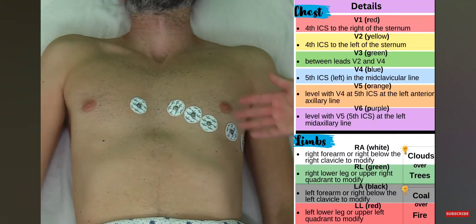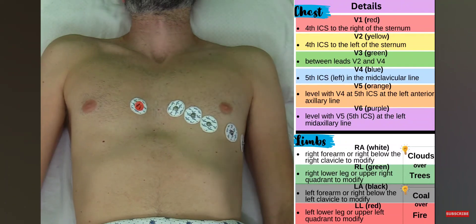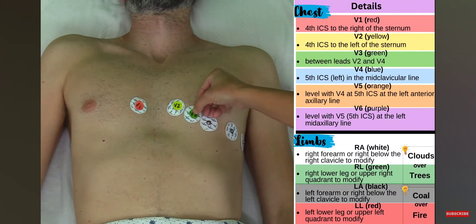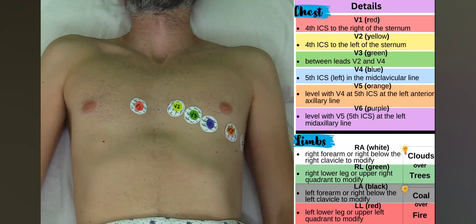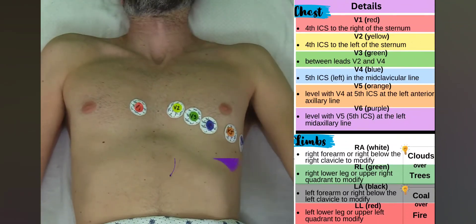Now let's go over the colors of the leads that connect to these electrodes. Again, colors can vary depending on the machine, but typically: V1 is red, V2 is yellow, V3 is green, V4 is blue, V5 is orange, and V6 is purple.